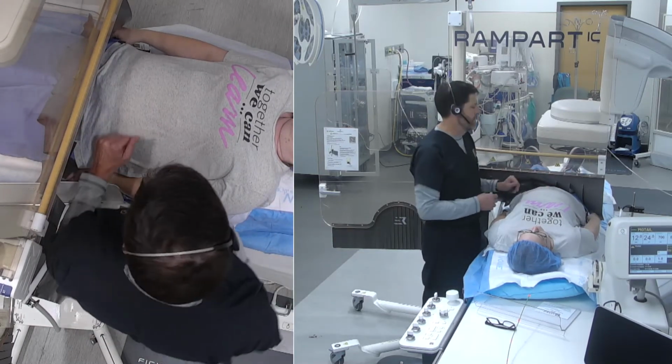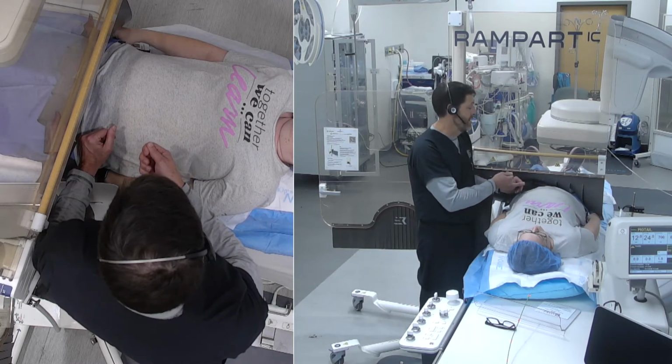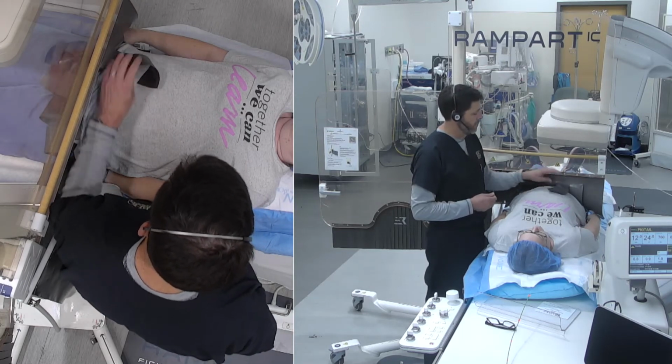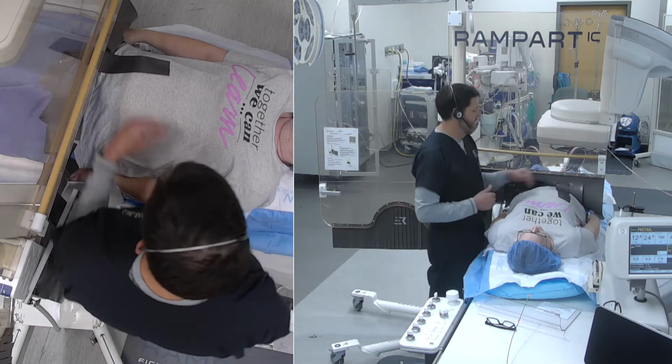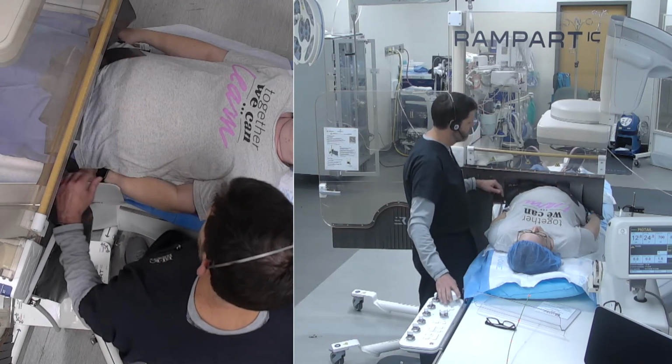I use standard sheaths and go straight down. I would secure that sheath. Again, you don't want the rack accessory to drag across that sheath and pull it out. You still have access to it, so you can see it and watch it fairly easily.